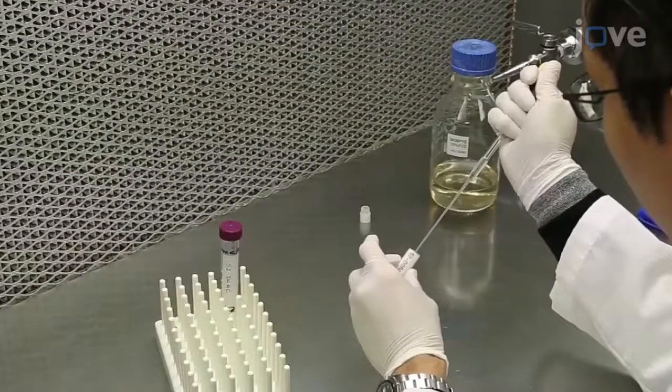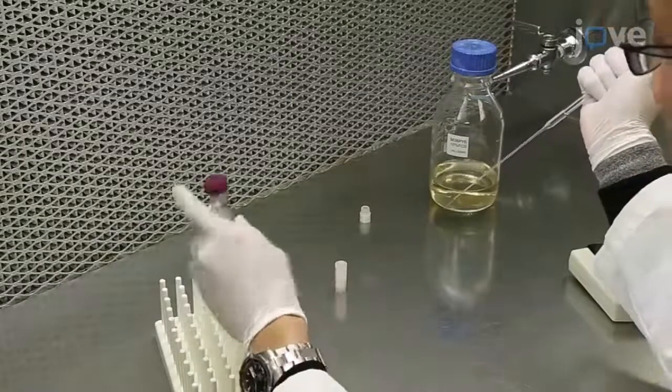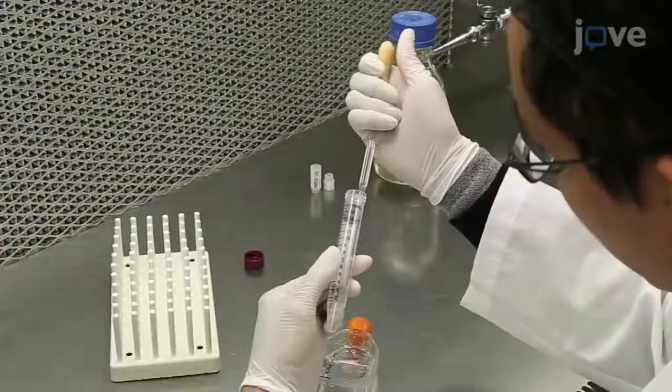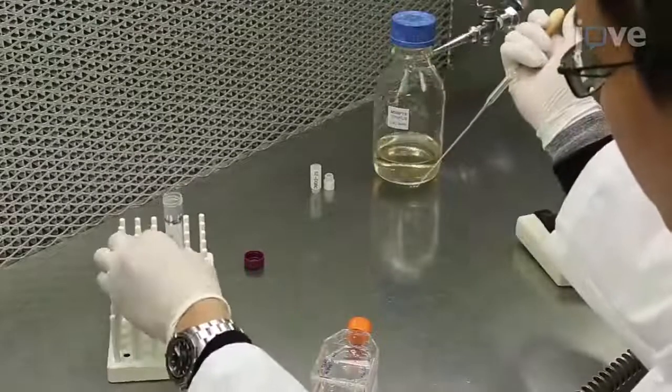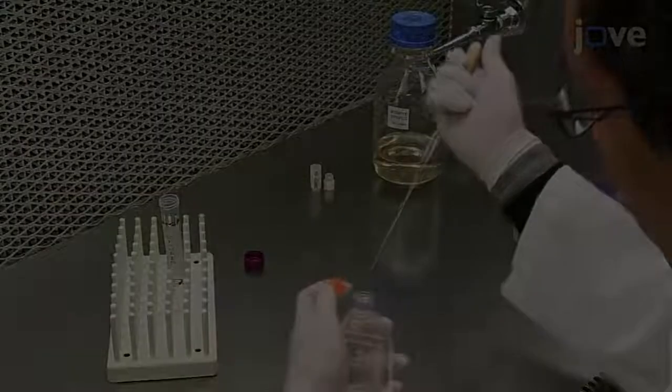Alternatively, after thawing, transfer the cell suspension into a 15 mL conical tube for centrifugation, and re-suspend the pellet in 5 mL of fresh medium before seeding into a T25 flask as just demonstrated.